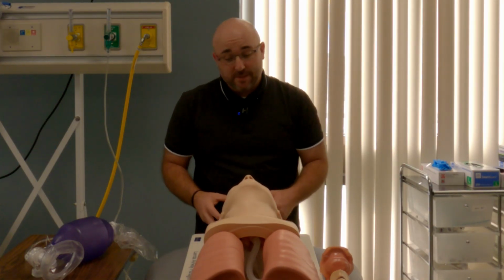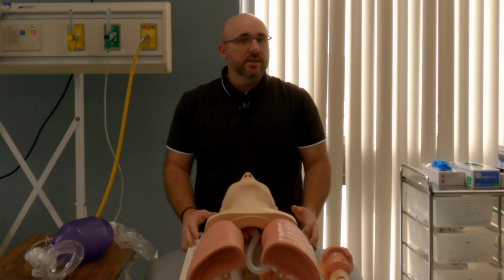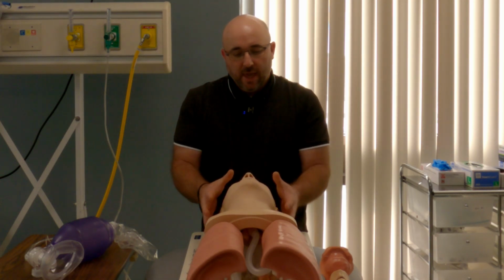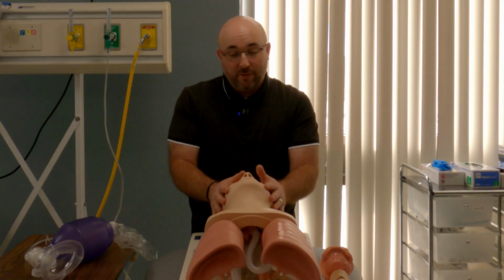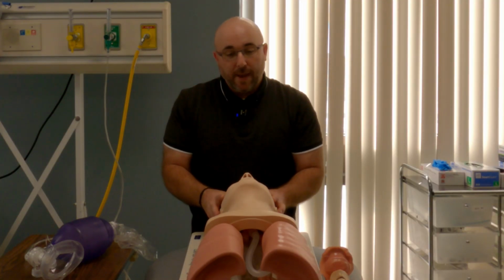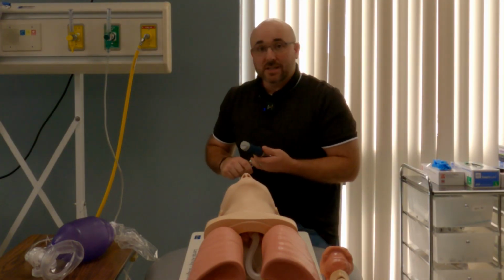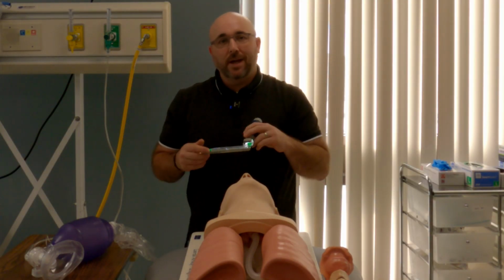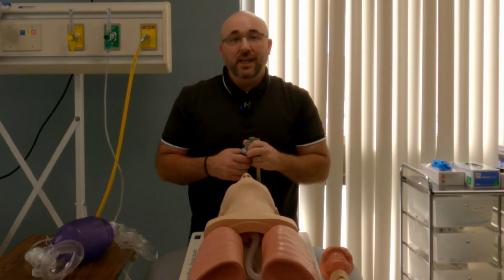And so in this case, the person intubating is going to be at the head of the bed, and that's the way it almost always is placed inside the healthcare setting or even outside the healthcare setting. Head of the bed gets you the best view of the patient, obviously their oral airway, and then down to their chest to look for chest rise. And so that person is going to be using, if we're talking about direct laryngoscopy or DL, a laryngoscope. And so I'm not going to talk about these today. I'm going to do another video where I talk about these a little bit. But this is an important key.